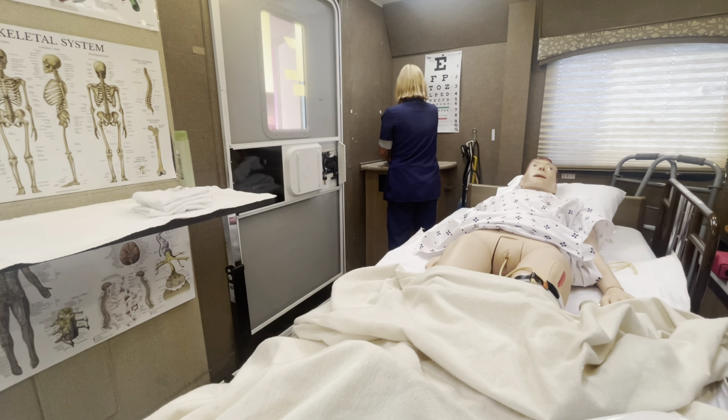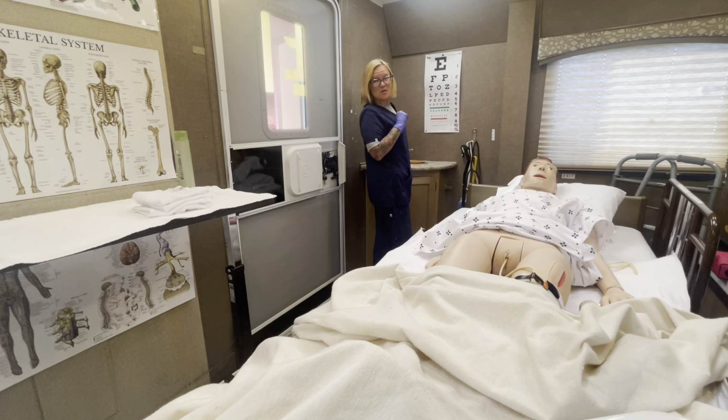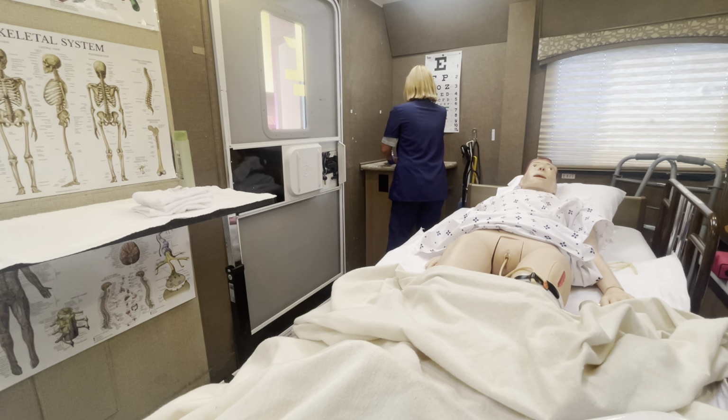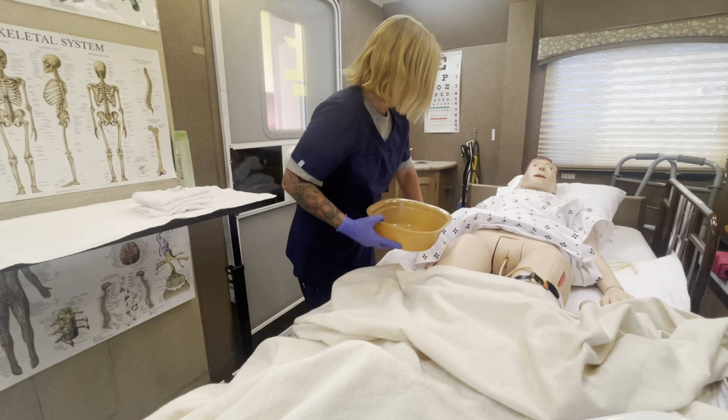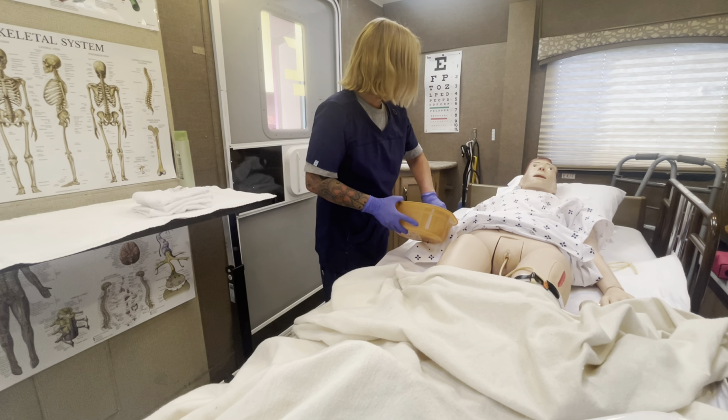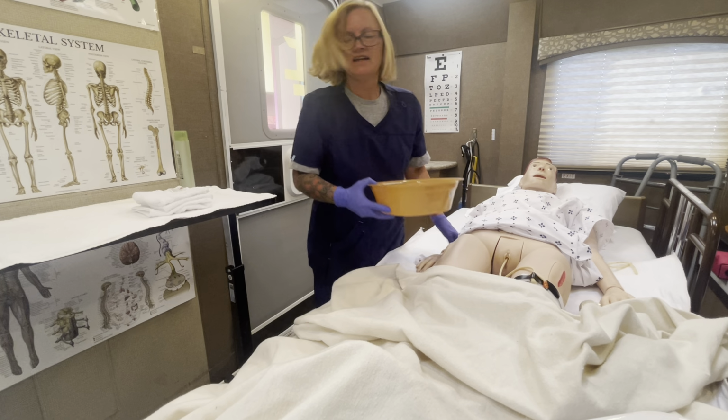You want to make sure that your water is warm, and bath water, ding, ding, ding, another question for your written exam, would be at 105 degrees. So I'm going to ask the patient if he would like to touch the water and make sure that it is at a comfortable level. It is.